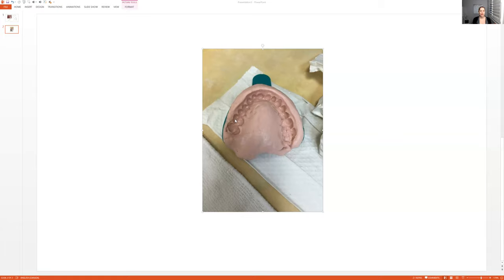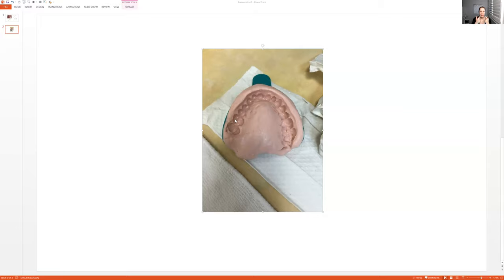And then same thing. Tell them it's just going to be about a minute. That's it. And then take it out after it has set. Same type of thing. If you try to take it out and it just doesn't come out easily, then you want to take your forefinger and your thumb and just sort of break the suction on the bottom. And then that's it. You should take it out, wrap it in a damp paper towel.